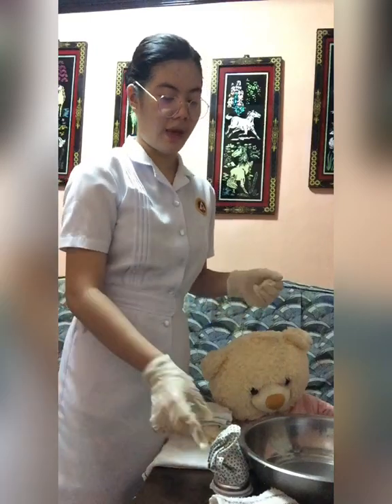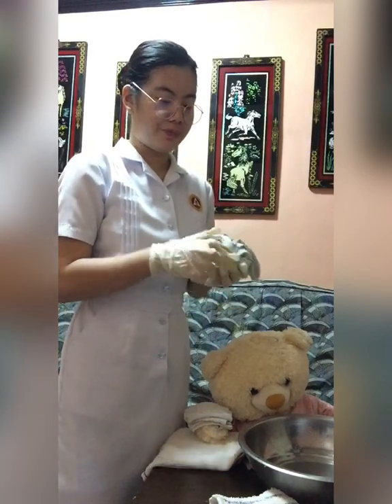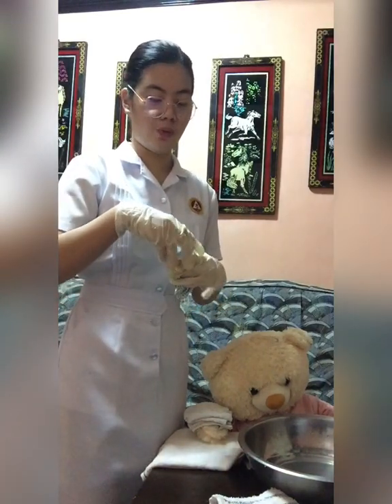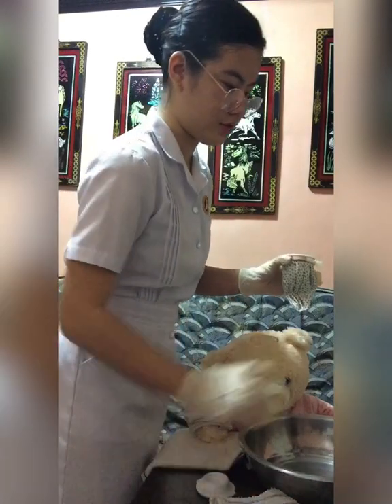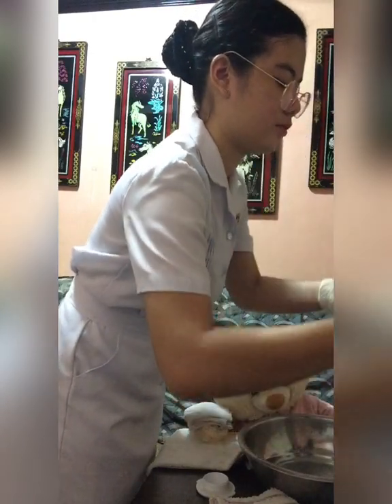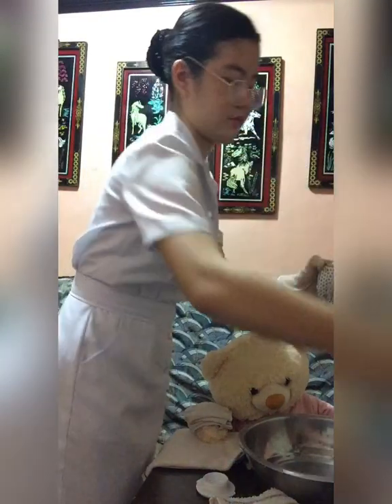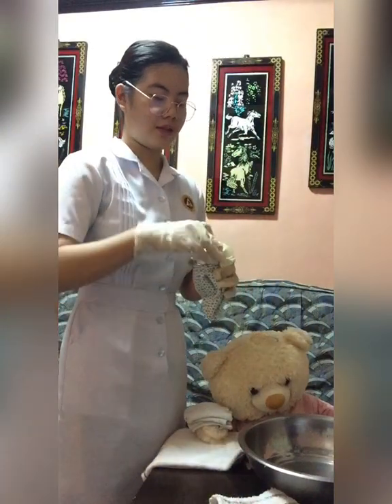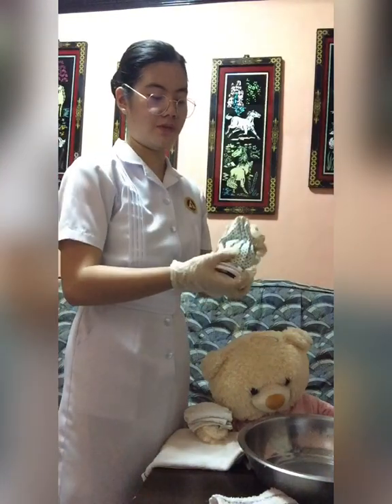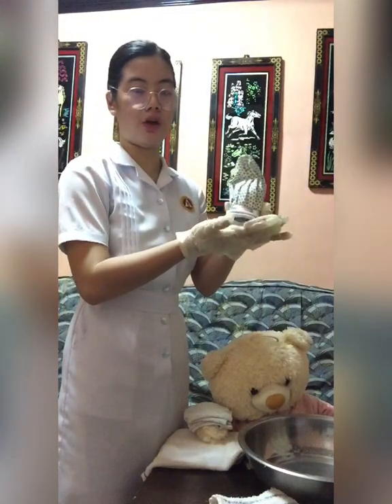And then next, apply the ice pack or bag. For the application of the ice pack and bag, fill the bag with water. Secure the cap, and then invert the bag. So if wala pong tumutulo, okay po siya.